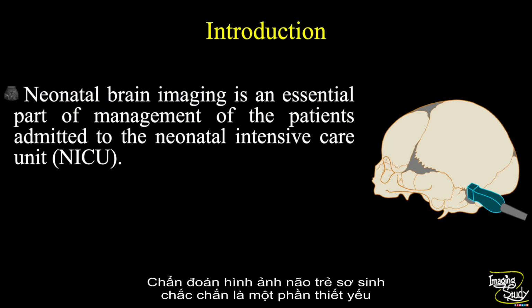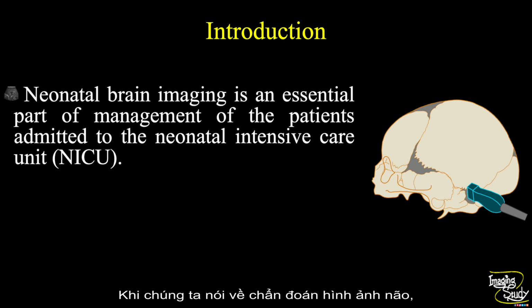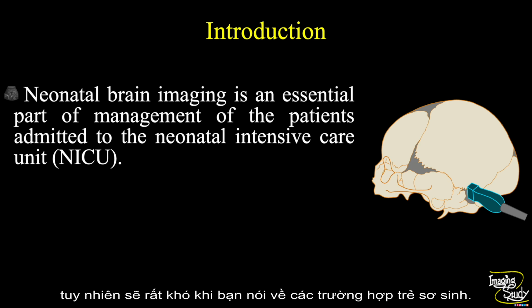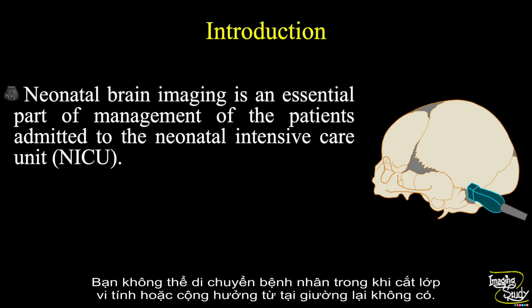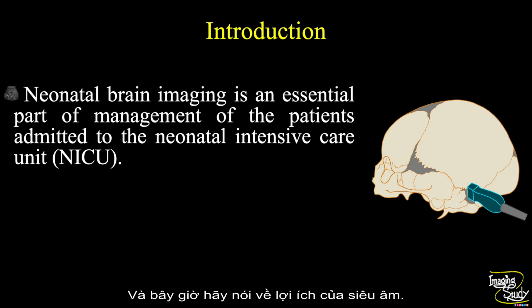Neonatal brain imaging is definitely an essential part of the management of patients who are admitted to the neonatal intensive care unit. When we talk about brain imaging, the things that come to mind are CT or MR imaging. But it's very difficult when you talk about neonatal cases. You can't mobilize the patient, and portable CT or MR facilities are not available throughout the world. There are some risks also, which we'll talk about a little later. So there comes the benefit of ultrasound.